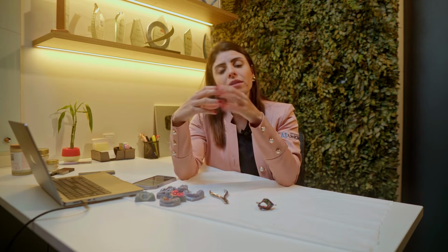So preferably, actually mandatorily, for any fixed appliance like a quad helix, for example, a Hyrax, or any other fixed appliance, you must use glass ionomer cement. I recommend a glass ionomer cement that is specifically for cementation. Some are for restorations, but the one for cementation is the right one. There are many good brands like Maron, which is excellent. There's a Brazilian brand, which is Vidrion C for cementation. They are all excellent, all right? You don't need an incredible, super expensive glass ionomer, no, because the secret to the appliance's retention is the adaptation of the bands. The cement is just there to be an interface, a contact between the band, which has good retention, and the patient's tooth.